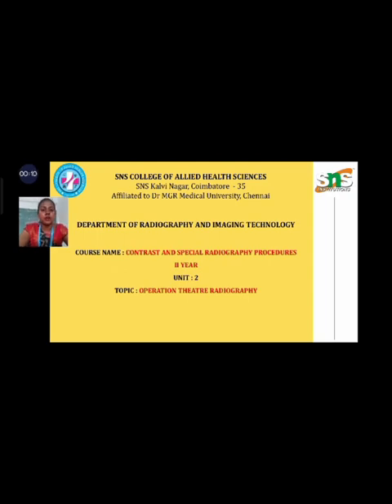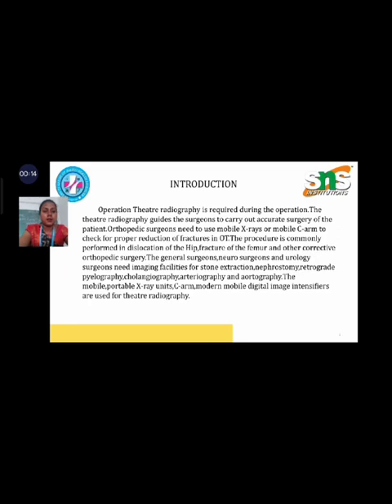I am going to discuss a topic about Operation Theatre Radiography. Operation Theatre Radiography is required during the operation. The theatre radiography guides the surgeons to carry out accurate surgery of the patient.